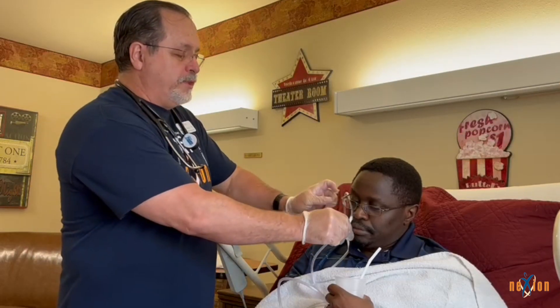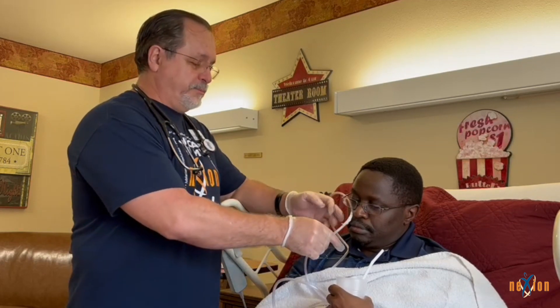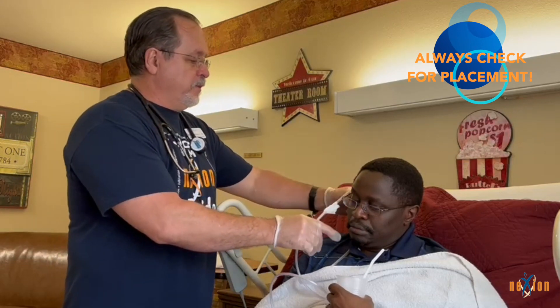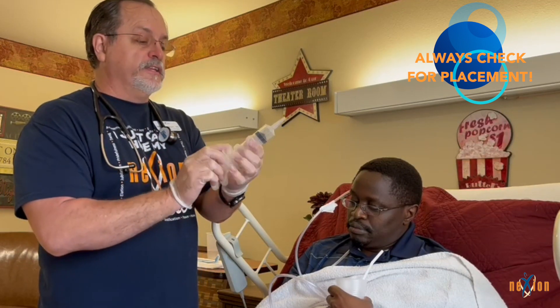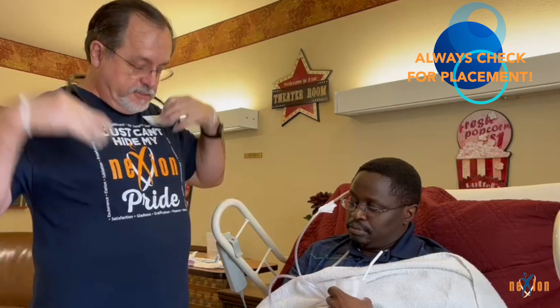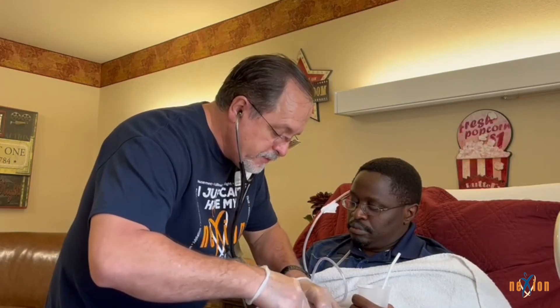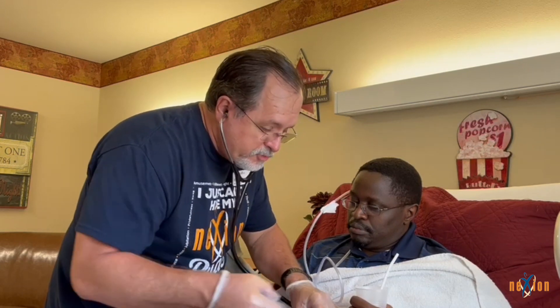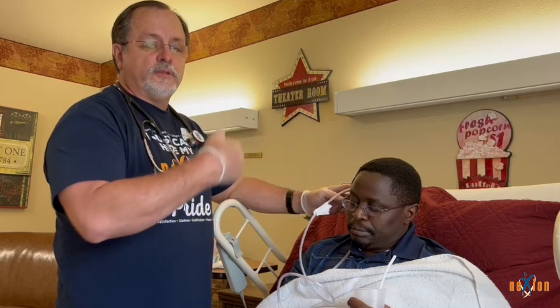Once you've inserted the tube to the tape mark, check for placement before securing it to the face. It's best to have a couple of nurses or staff members helping you. To check placement, take the 60cc syringe and draw up 10cc's of air. Place your stethoscope on the abdomen, inject the air into the NG tube, and listen for bubbling in the abdomen. If you hear the air exchange, you know the tube is in place. If you do not hear it, pull the tube back out and readjust to make sure it is in the correct location.